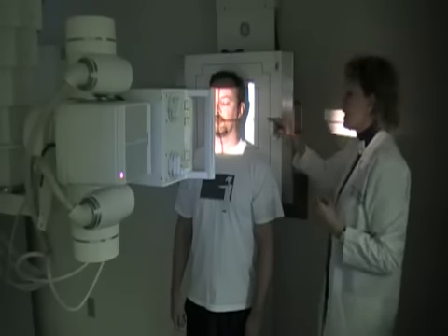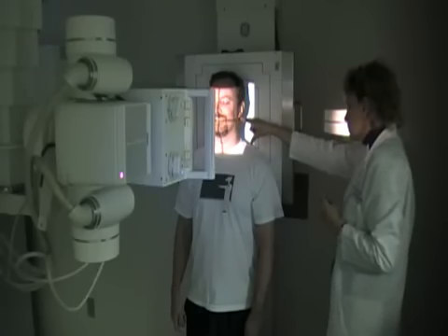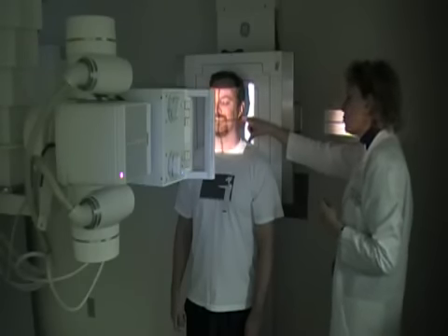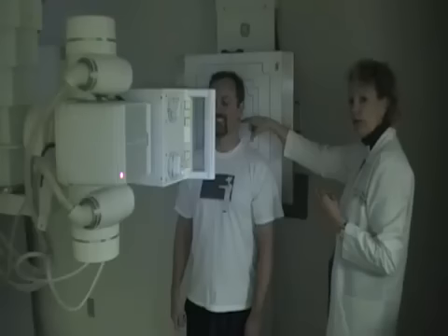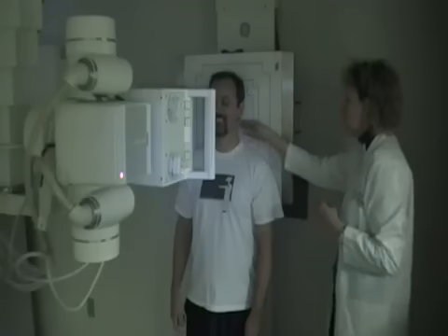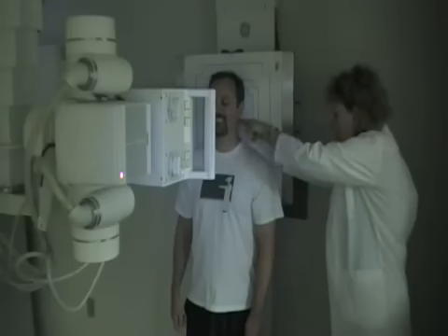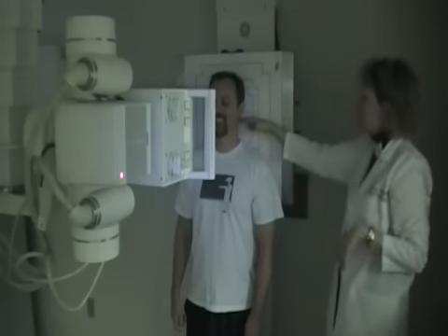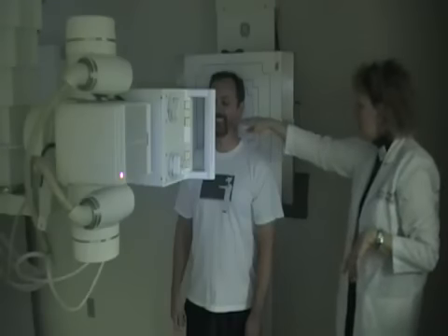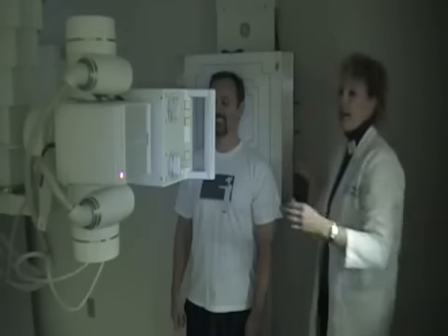You want the upper teeth occlusal line going straight across and cutting across this posterior portion of the base of the skull, or the mastoid tip that's right behind the ear. Those are both at the same level. So you can palpate this and just check your line that leads from the upper teeth to the back of the skull there.